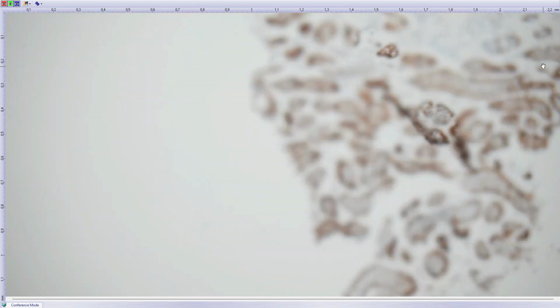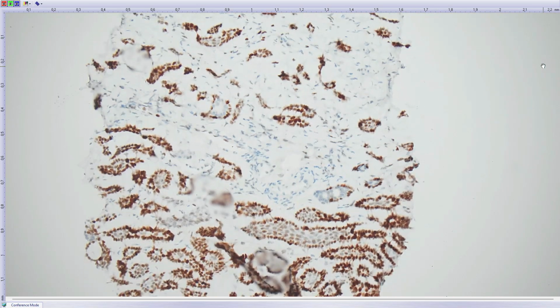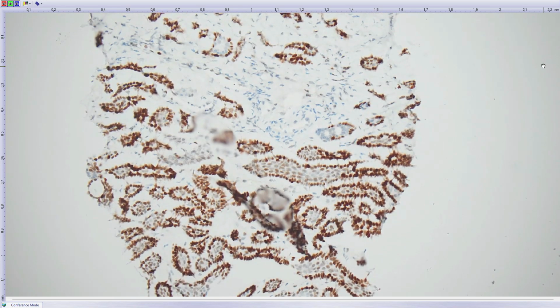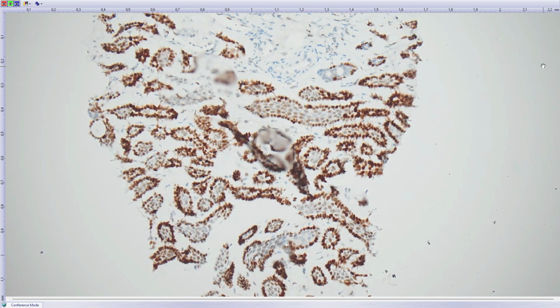It's a nuclear marker and much easier to interpret the staining, and it will give you this positivity in these abluminal cells. So now the diagnosis is basal cell adenoma. Basal cell adenomas of salivary glands have beta-catenin mutations, and we have proxy markers for that. That is immunohistochemistry for beta-catenin protein and LEF1, which is much better compared to beta-catenin.